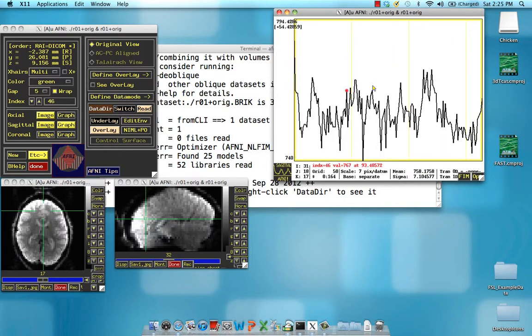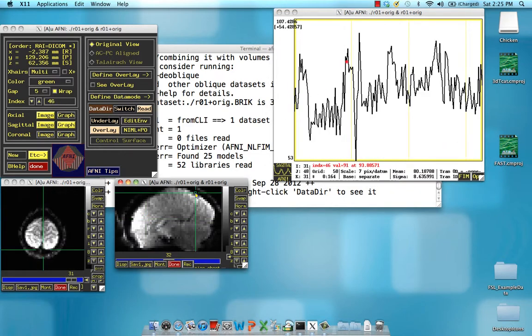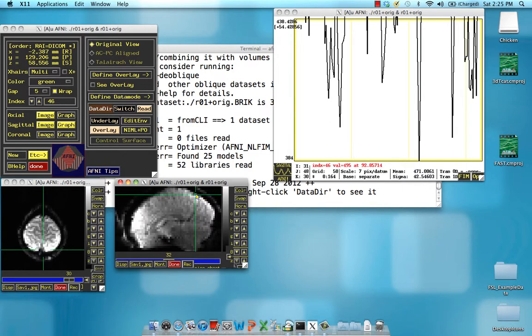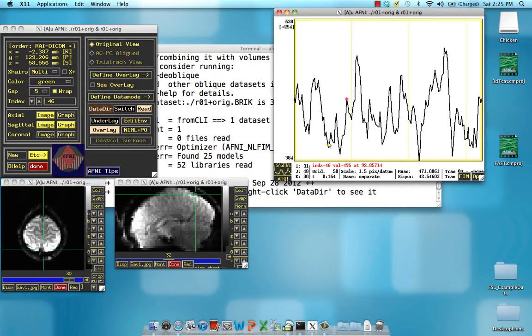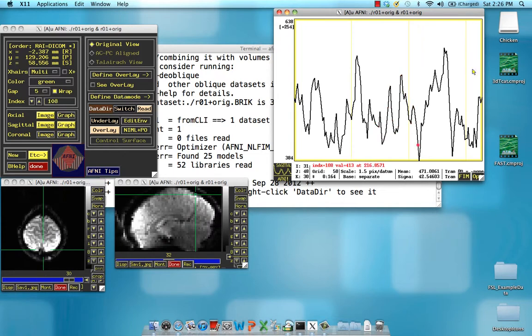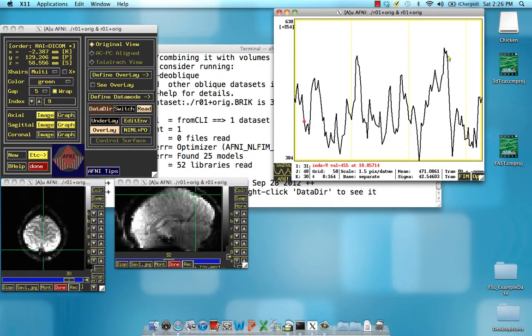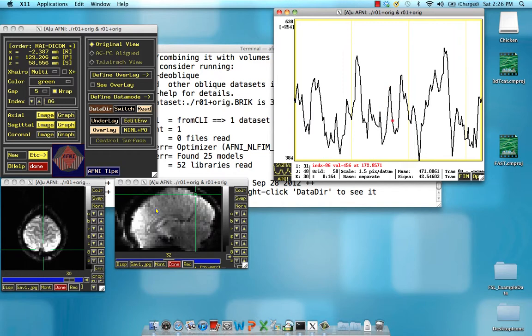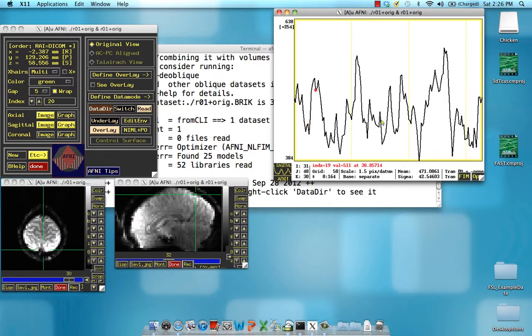And it's also a very good habit to select one of the voxels at the very edge of the brain, some spot where it might be susceptible to head motion, for example, and then to click in this graph pane and press the V key to enable video mode. So if you see any very sudden spikes, that could be due to head movement. And by enabling video mode, you can look in this pane and see whether any of these spikes correspond to any sudden head motion. Now, if that happens, you might want to censor those time points when you construct your model at a later stage. But so far, this one looks pretty good.